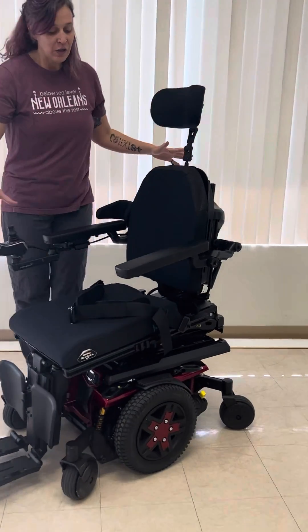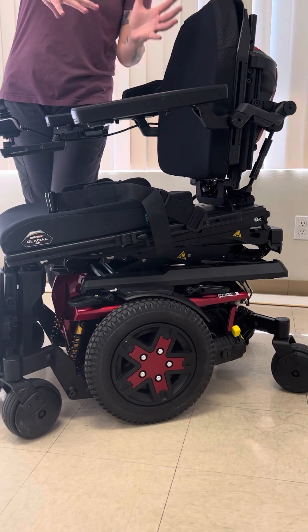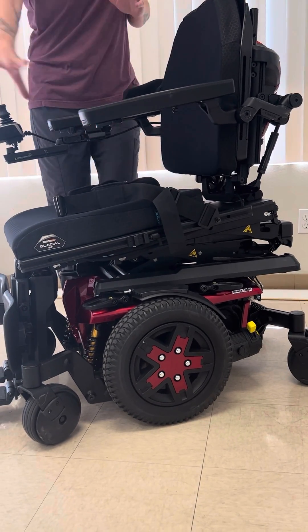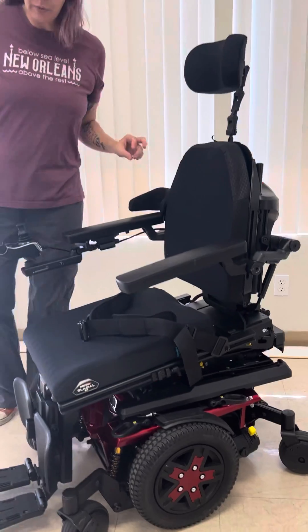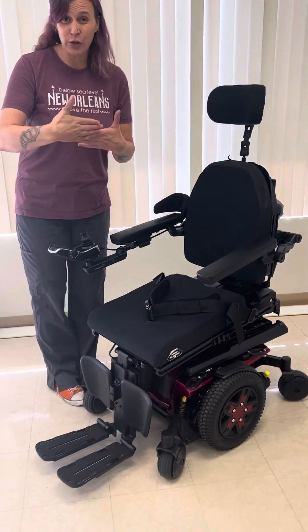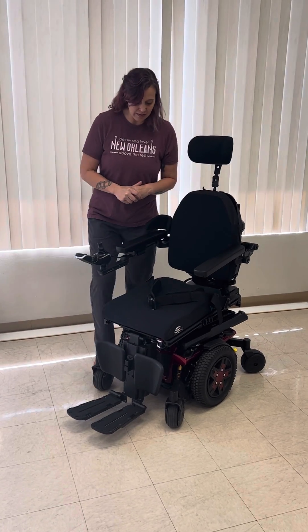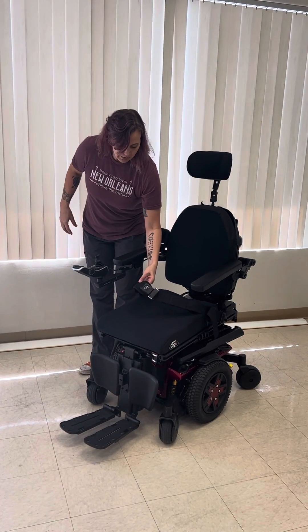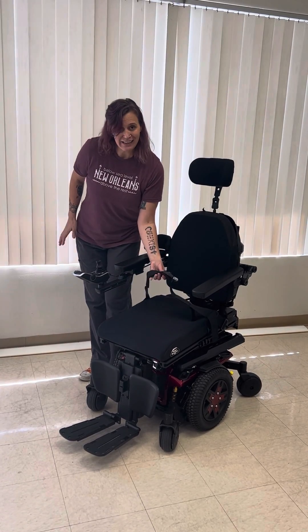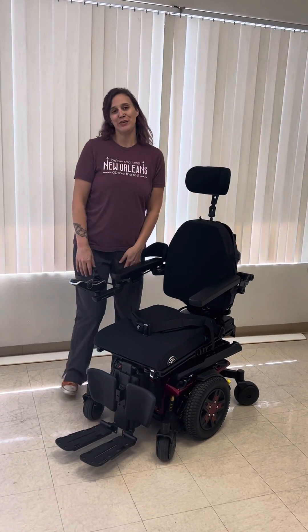This is what that 10 degrees looks like — it's not a lot of forward position, but it definitely makes you reach farther. The foot plate can often prevent you from getting close to things, so this can help get you a little bit closer. Some things to consider: if you have balance issues, you may want to get a padded hip belt to help make that a little more comfortable while you're doing your activities.